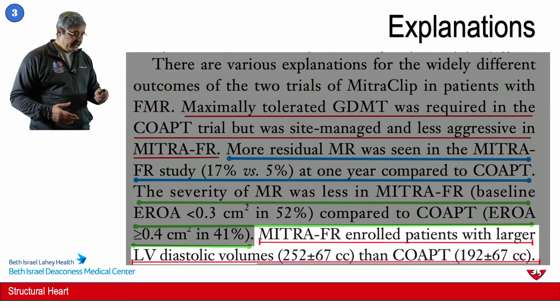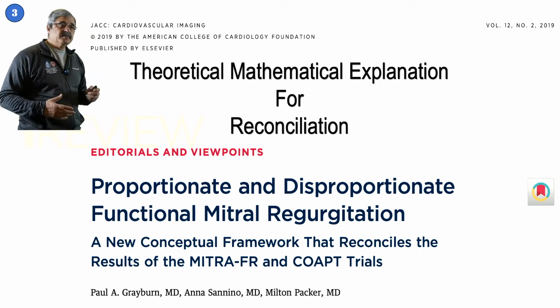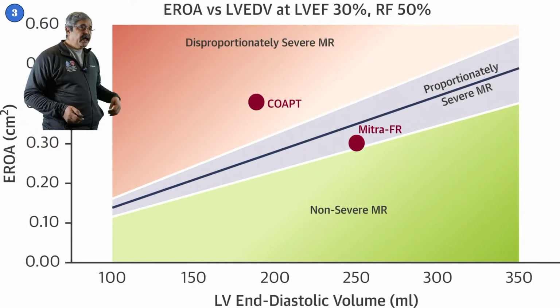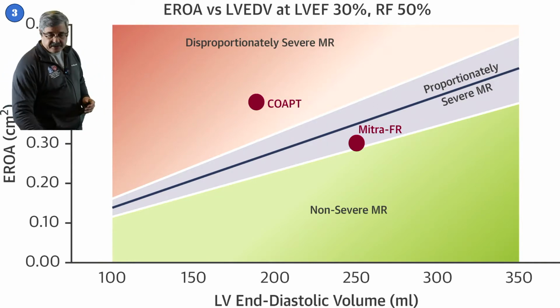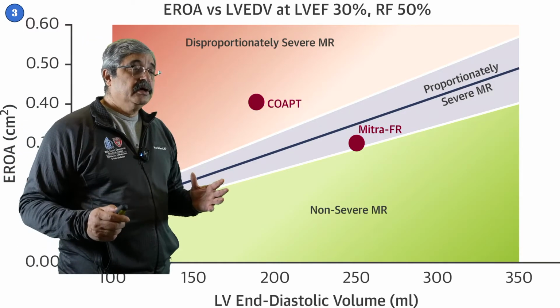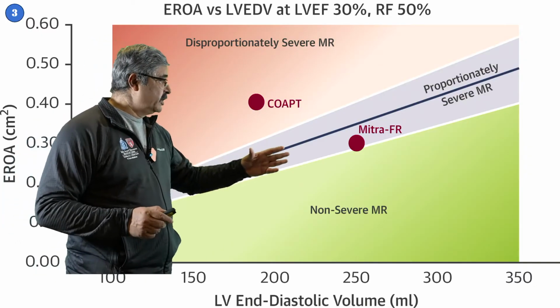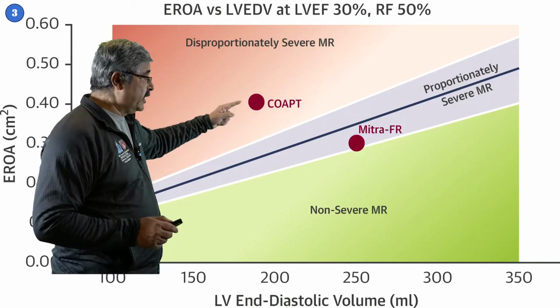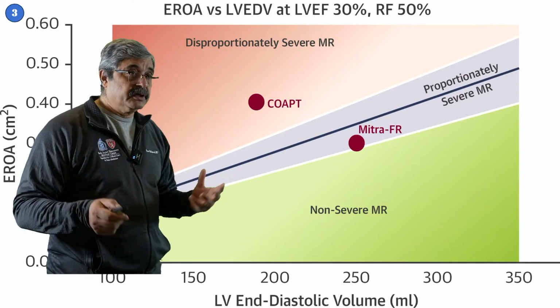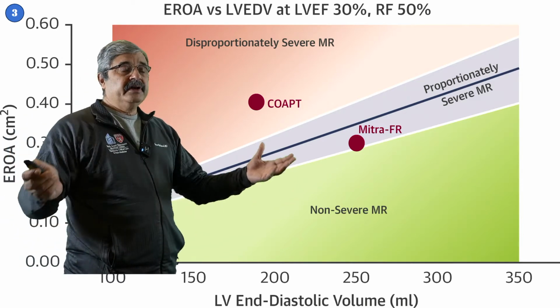Now, this is a very important thing, and that brought in a theoretical mathematical explanation to reconcile these opposite results, and that is the concept of proportionate and disproportionate MR. While it's a lot of mathematics, let me try to simplify it for all of you. It implied that in the MITRA-FR trial, which you see up here, the patients had large left ventricles, which means the severity of MR was proportionate to the left ventricular dysfunction. So all of them had proportionate mitral regurgitation. As opposed to that, the patients in the COAPT trial had smaller left ventricular volumes, which means their mitral regurgitation was disproportionate to the severity of the LV dysfunction, which means the LVs were not that bad, and the leaflets had something to contribute to mitral regurgitation, and therefore, when we did an edge-to-edge repair, they did better.